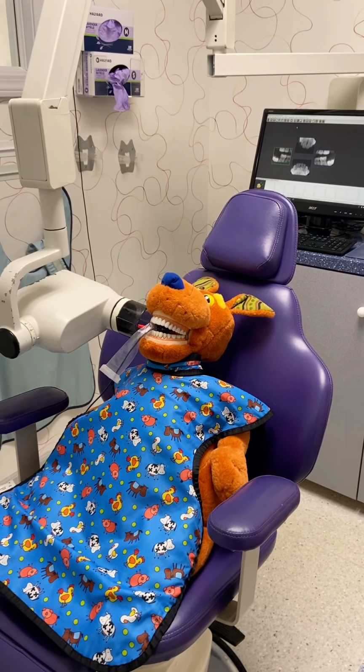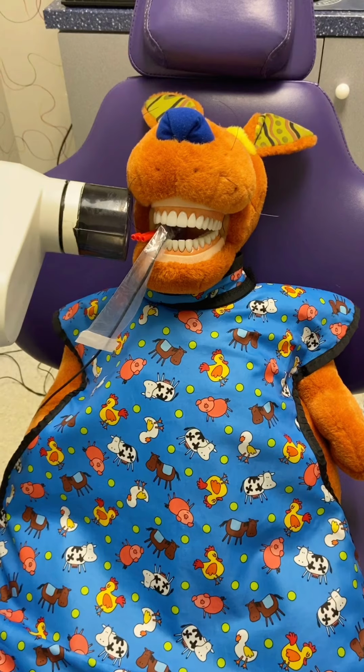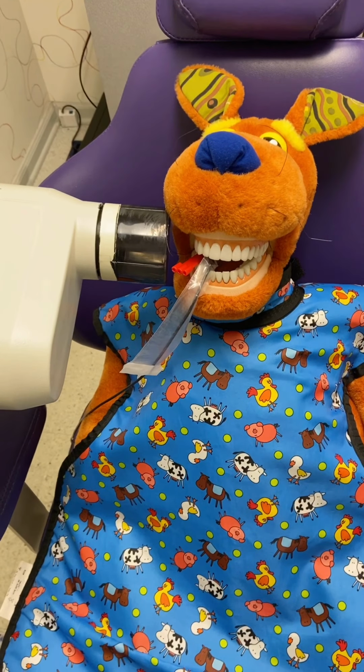So this time I actually have my kangaroo friend who's sitting in a chair. He's wearing a nice little cozy blanket. It's kind of like a coat. So whenever you have x-ray pictures taken of your teeth, you always have to wear something to cover up your body so that you're not taking pictures of parts that we don't need. You can see that he's actually holding something in his mouth in there already, and that's the picture part for us.